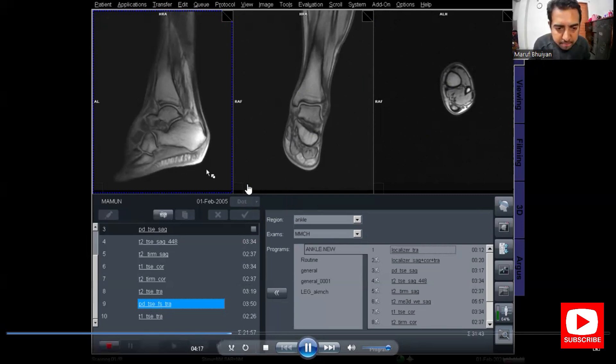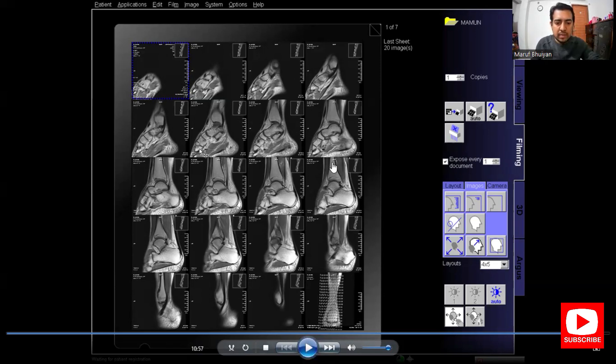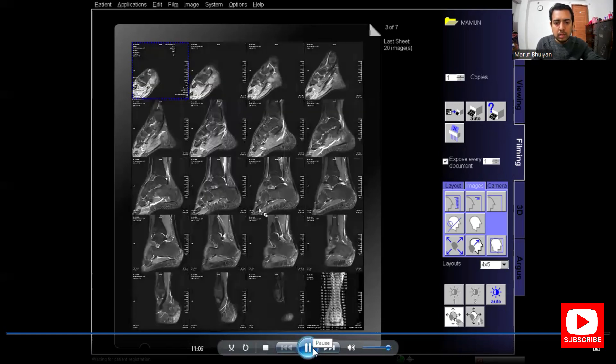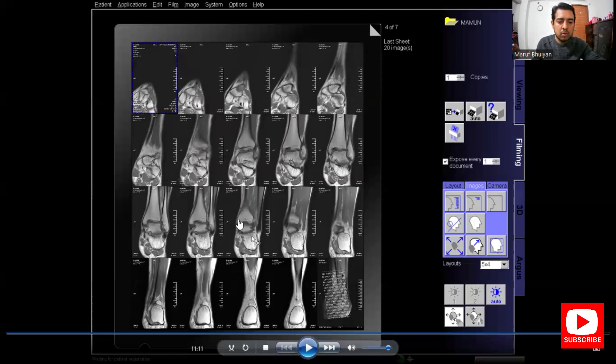Now I will film or print the images. The first film is the PD-sagittal. I select a 4×5 format, giving 19 sagittal images and one reference image. The second film is the T2-sagittal, also in 4×5 format. The third film is the T2-STIR sagittal, also in 4×5 format. The fourth film is the T1-coronal.